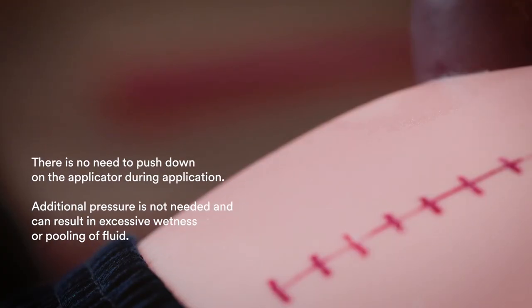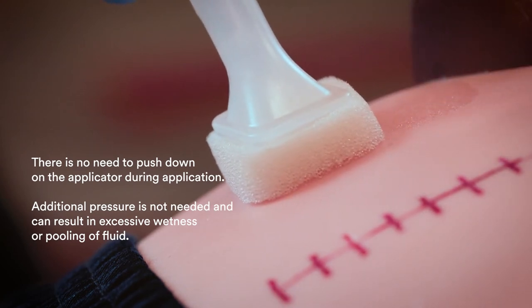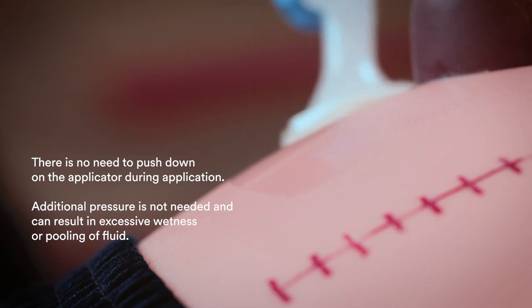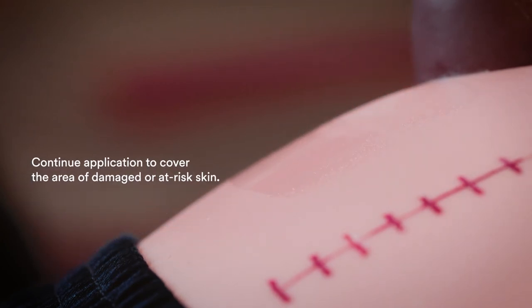Do not paint back and forth over the same area during application. There is no need to push down on the applicator during application. Additional pressure is not needed and can result in excessive wetness or pooling of fluid. Continue application to cover the area of damaged or at-risk skin.